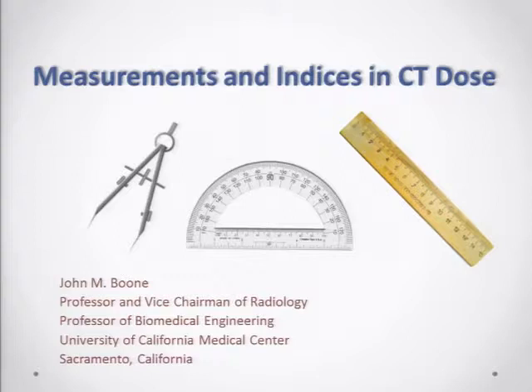Yes, we did a pretty comprehensive assessment of a solid-state phantom, and I think that with work, solid-state phantoms could be made to be accurate, and if you just want the shape of the curve, they'll probably be accurate. Solid-state phantoms work great when you're making measurements in air because you know what the spectrum is in the absence of scatter. At the center of a big phantom in a CT, the scatter-to-primary ratio from the Monte Carlo work I did was 13 to 1, 13 scattered photons for every primary photon. Who knows what the X-ray spectrum looks like there? So the energy correction in that environment is very difficult and probably won't be as accurate as we would like. Given that there is air ionization technology for that, that's my own bias. I know that others will end up using solid state. And of course, that just becomes a calibration issue at that point. Okay, thank you.